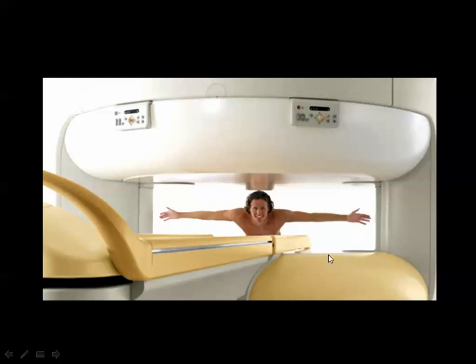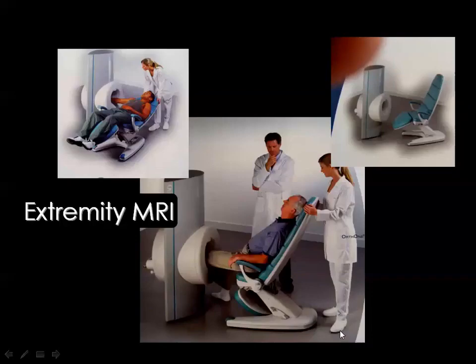Then we have the third MRI machine, which is known as the extremity magnet, and this can fit for examination of the upper limb, including the elbow and the wrist joints, as well as the lower limb, including the knee and ankle joints.